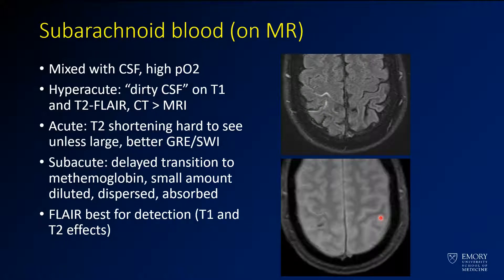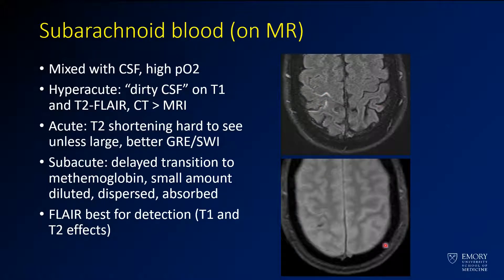On MRI, subarachnoid hemorrhage can have a somewhat different appearance. What you'll most often see is a little bit of dirty CSF. Here on a FLAIR image, you're seeing T2 hyperintensity in the sulcus — you're not getting completely suppressed CSF signal. On gradient or susceptibility imaging, you'll have dark linear areas of susceptibility in the sulci themselves. In general, FLAIR and susceptibility imaging are the best sequences for detecting subarachnoid hemorrhage.